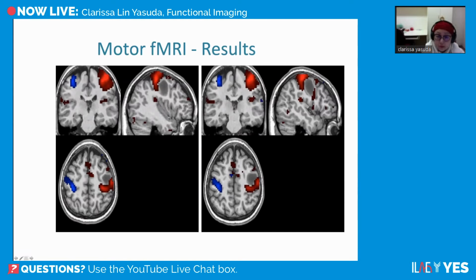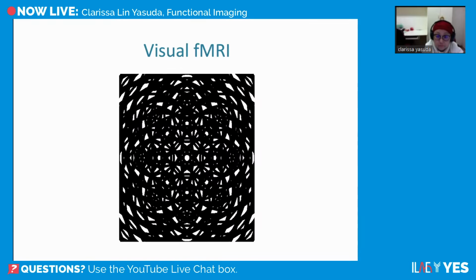And now we can overlay the activation map on top of the structural image. And we can see the relationship between the activation map and the lesion. It is nice because the surgeon can plan ahead, can consider the implications of the surgery and talk with the patient, right?